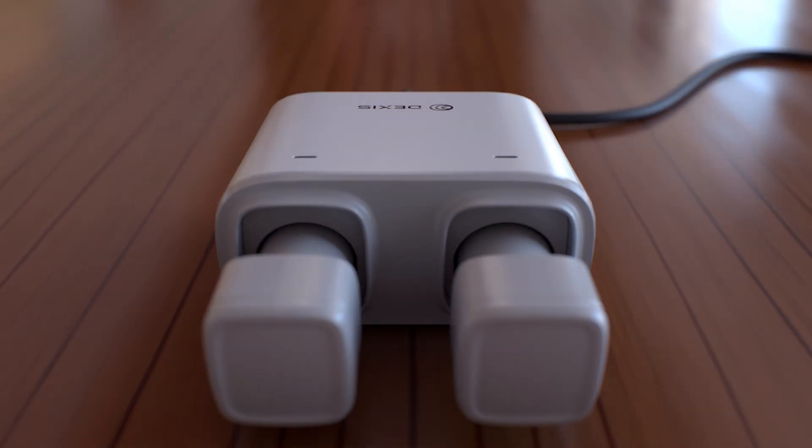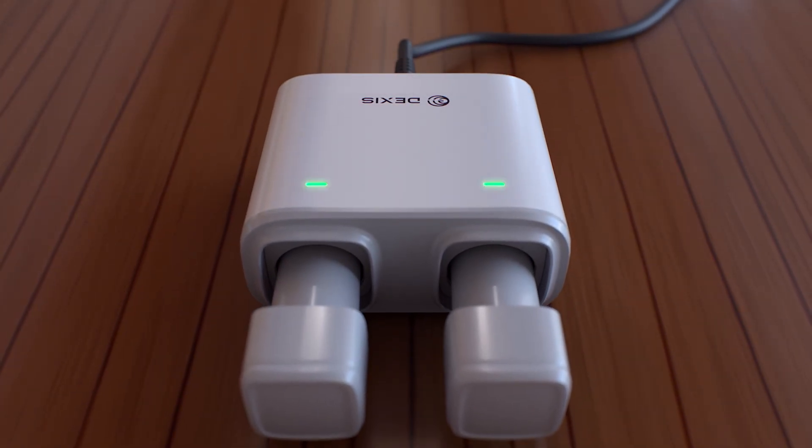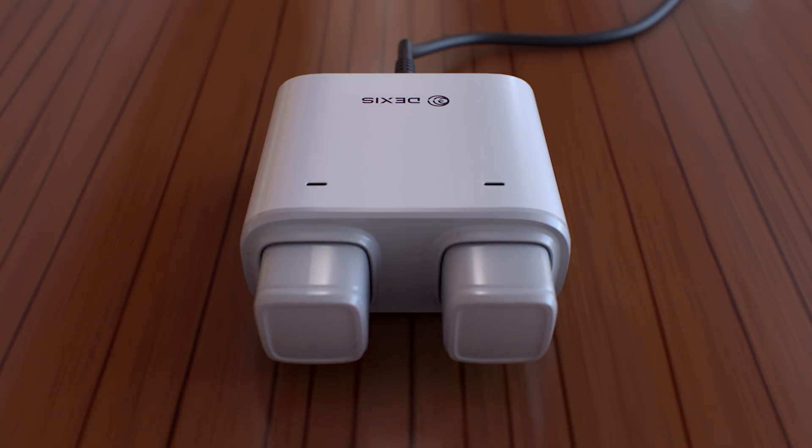The battery charger features clear status indicators. Green: powered on. Blinking blue: charging with sufficient battery. Blinking amber: charging but battery is low. Blue: fully charged. Yellow indicates an error.